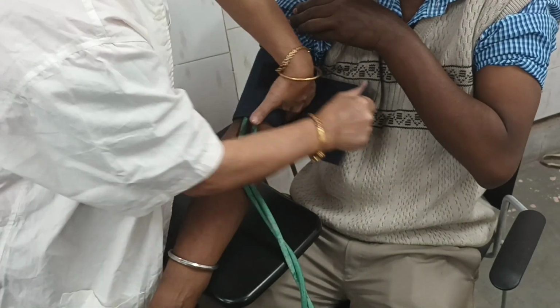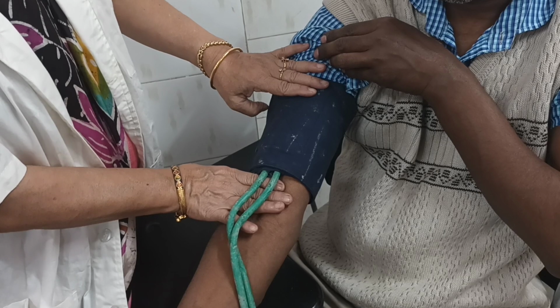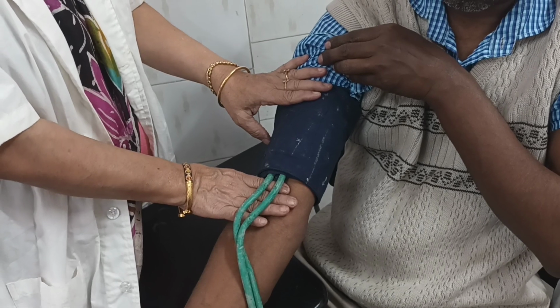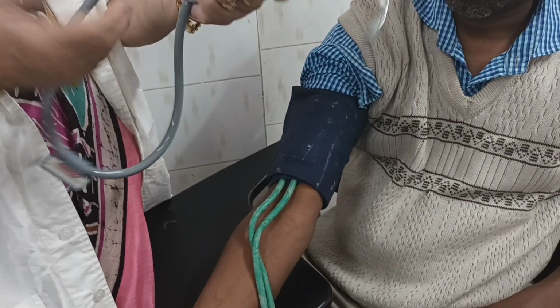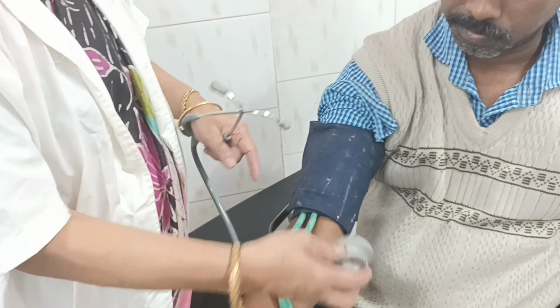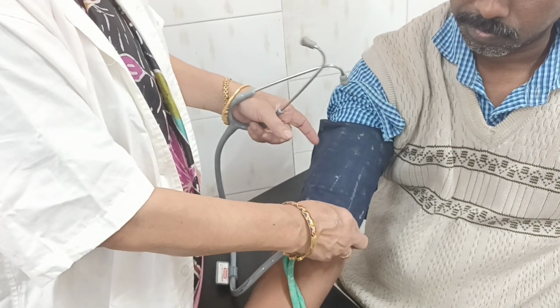Now, pull it tightly as far as possible. See, this is 3 fingers above the bend of the elbow. Why 3 fingers above the bend of the elbow? That is 1.5 inches above. 2 fingers is 1 inch, 3 fingers is 1.5 inches. This leaves space for the chest piece of the stethoscope, which you have to place over the brachial artery. It should not be too tight or too loose, just admitting one index finger. This is how to tie the cuff.